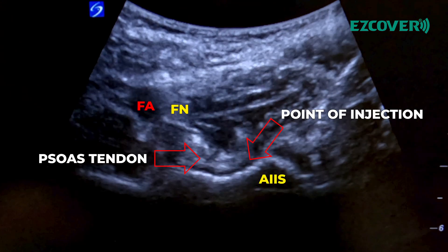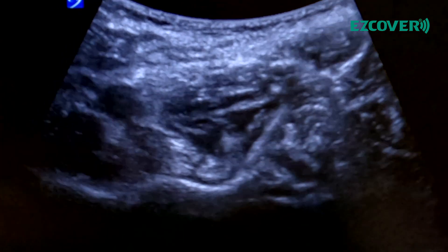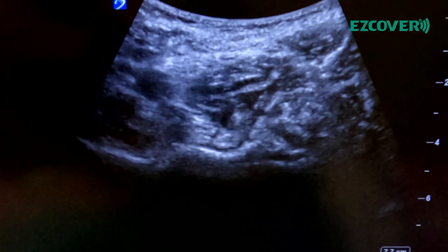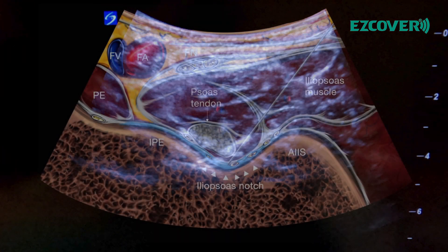Advance the needle, keep going. Aspiration is negative. Here's the proper injection — pull back a tiny bit. Perfect.